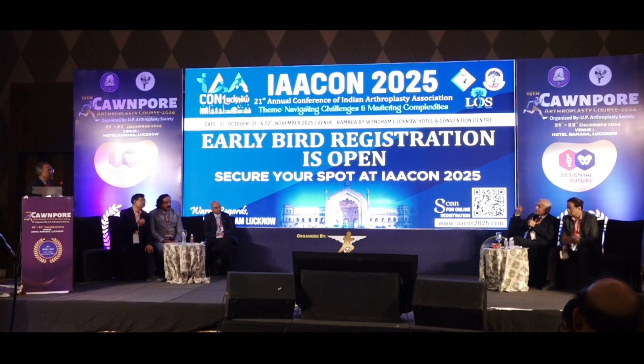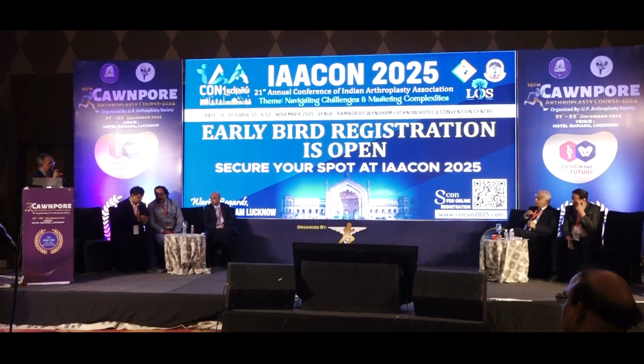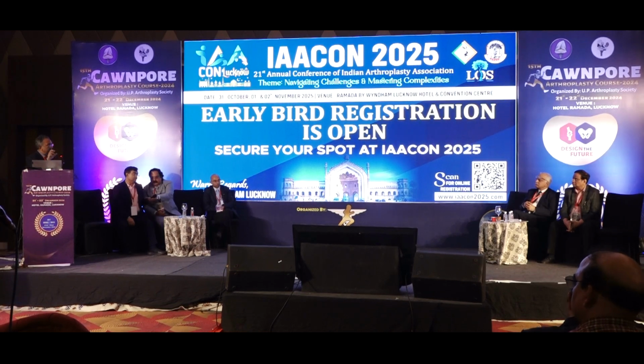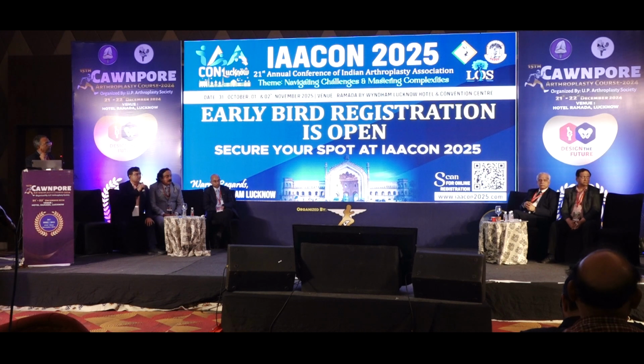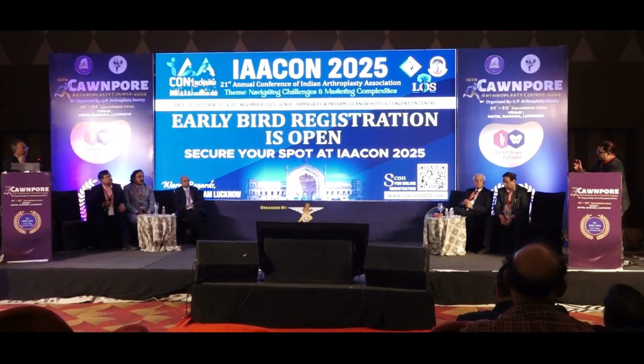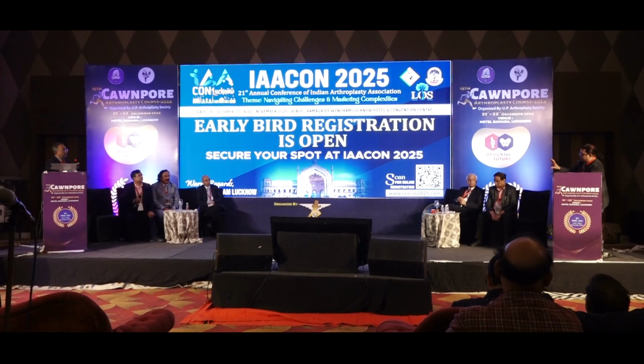How do you decide the thickness of the tibial base plate? When we prepare the femoral spacer, the femoral component, we again check with these molds of the tibia. They come in a couple of sizes, not only one size, and you can also increase the thickness. The amount of cement you can also put more, and then according to the flexion and extension gap that you see on the table, you can put the correct size of thickness and the correct size of femur as well.